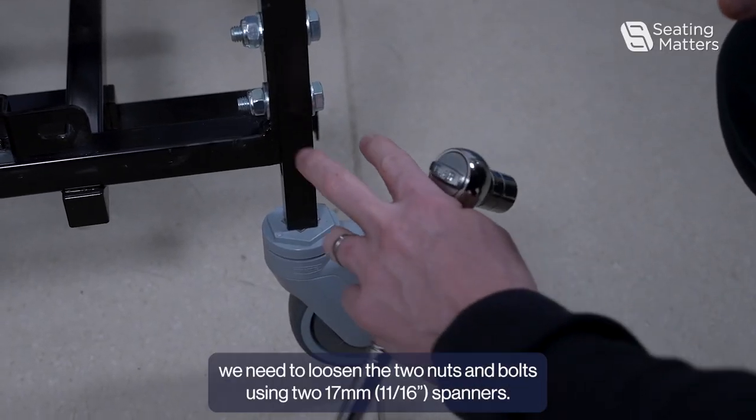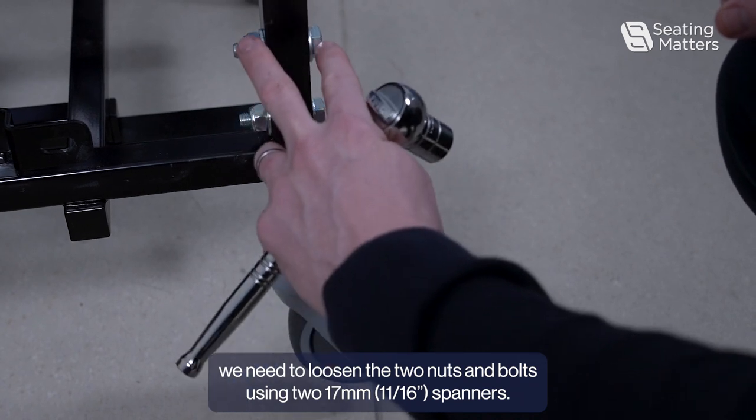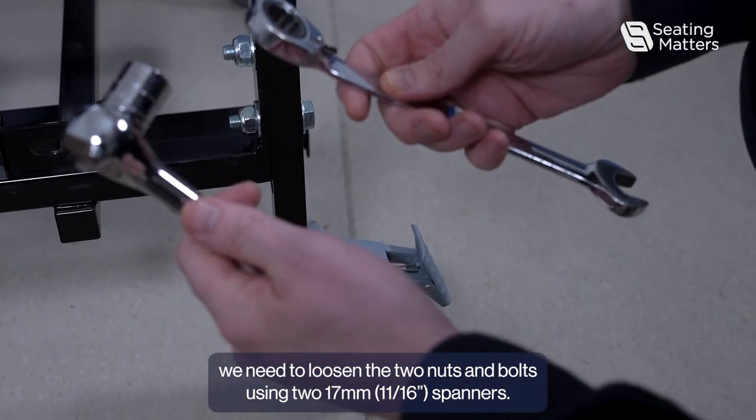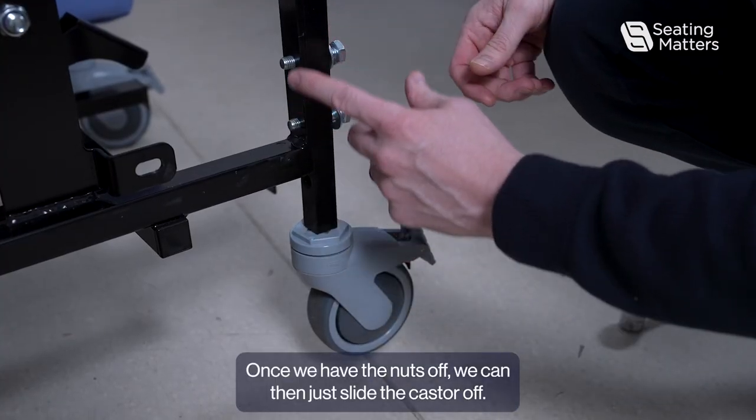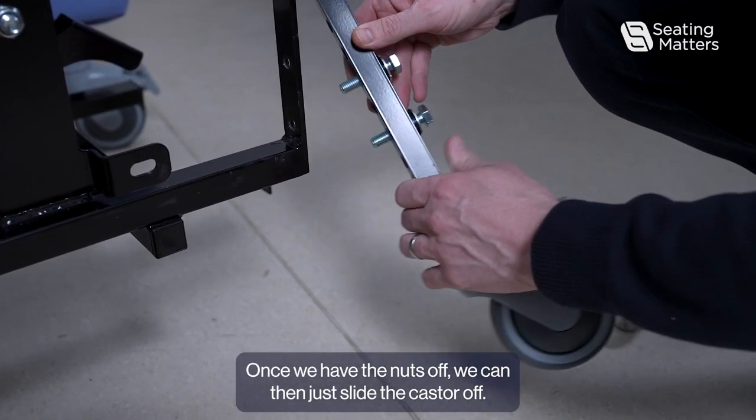To remove the caster, we need to loosen the two nuts and bolts using two 17mm spanners. Once we have the nuts off, we can then just slide the caster off.